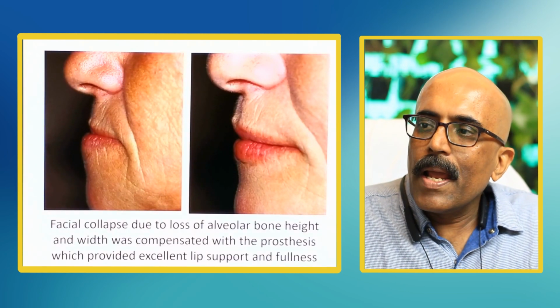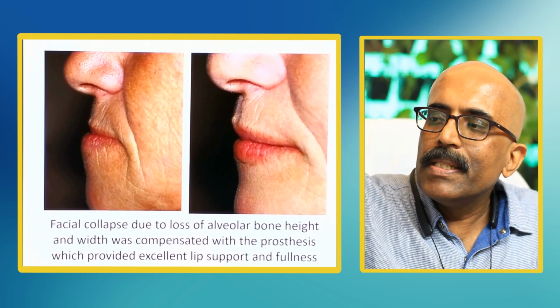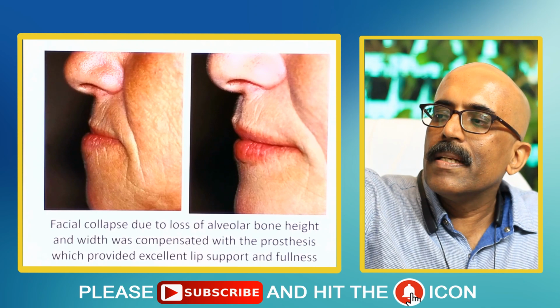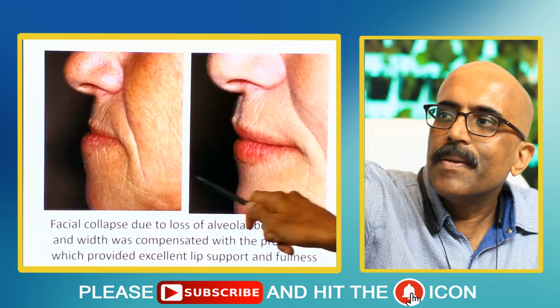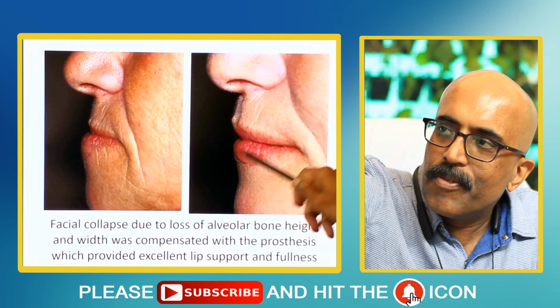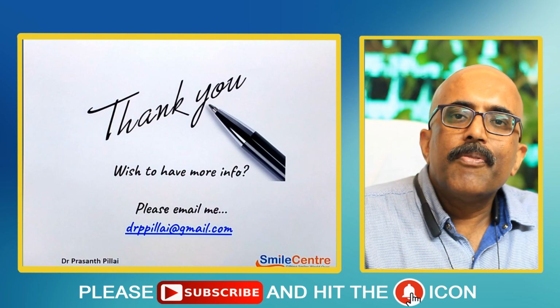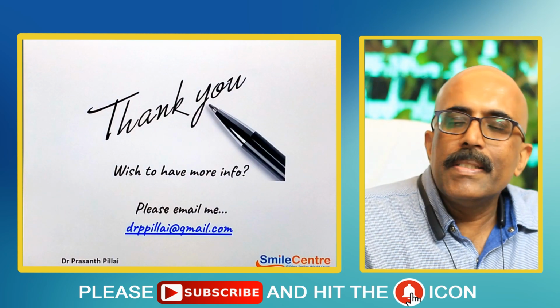And the facial collapse due to loss of alveolar bone height and width can be compensated with a prosthesis which will provide excellent lip support and fullness, as you can see here. So this is a typical representation of how we are able to provide excellent fullness to the lip with the help of a prosthesis.